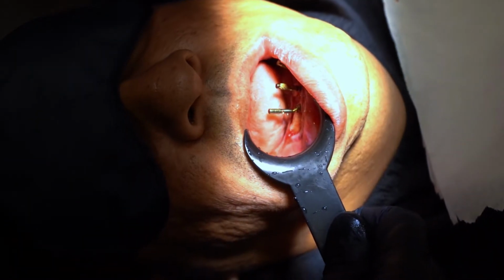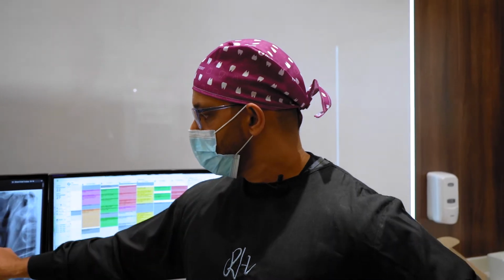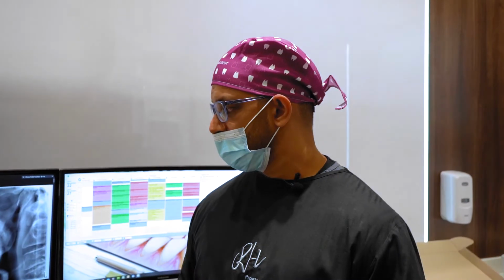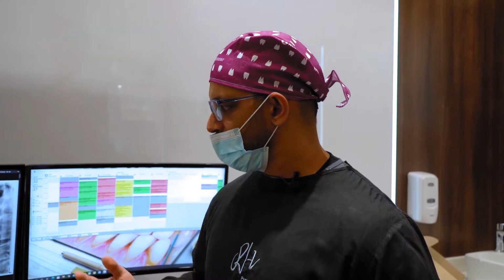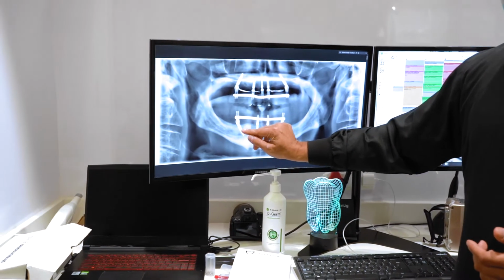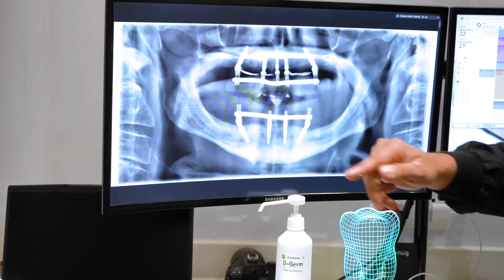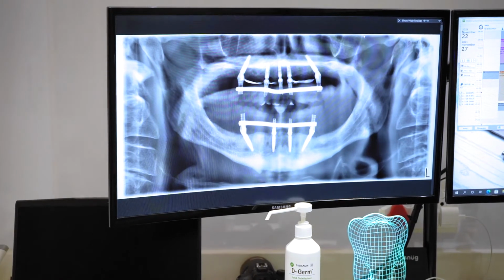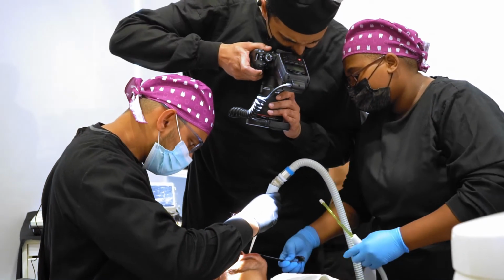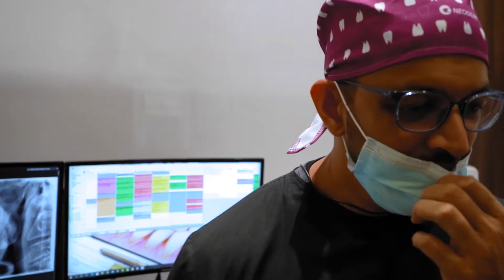So ultimately what's happening right now is Dr. Bansi is placing those implants, and once the implants have been placed, I'm going to get in there and choose the correct angled abutments to use here. These abutments either come as 0 degree, or they come as a 17 degree or a 30 degree. And I choose the correct angled abutments with the correct heights. And the height would basically mean how deep the implant is placed in relation to where the gum is. So the implant is placed at the bone level, and the gum level is slightly higher than the bone level. So angles and heights become important at this stage. Place the abutments, make sure all my abutments are parallel, and then we can take the impressions from there afterwards. Let's go have a look.